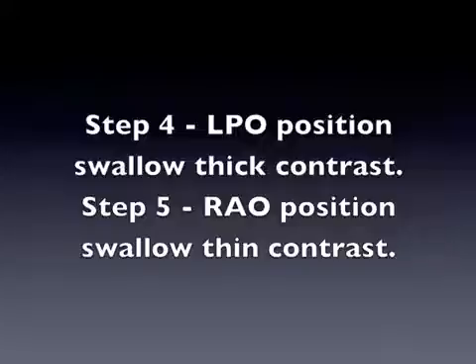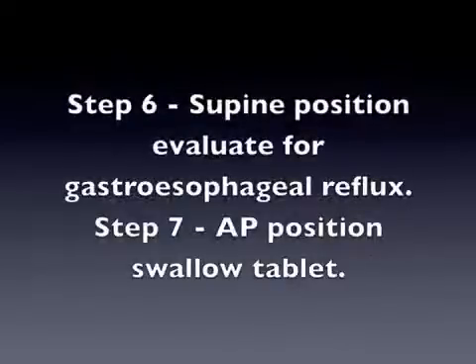Step 5, RAO position, swallow thin contrast. Step 6, supine position, evaluate for gastroesophageal reflux. Step 7, AP position, swallow tablet.